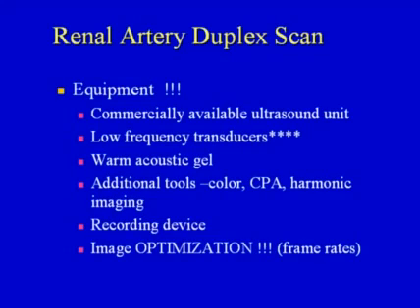You cannot do this with smaller units. You need to have a lot of power. You're going to look at small vessels at very deep depths, so you need low-frequency transducers and warm acoustic gel. Additional tools: use everything that you have.